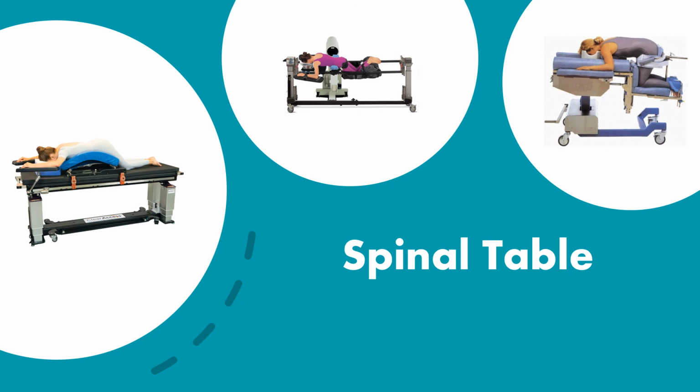Same thing we want to think about when we are putting a patient on the spinal table as we do when we are putting them in the prone position. We want to make sure that bony prominences are padded, that the feet are padded, that they're in the safest, most comfortable position possible. The head is going to be positioned on a headrest similar to prone. And it would be nice if we had approximately 6 people to do this.